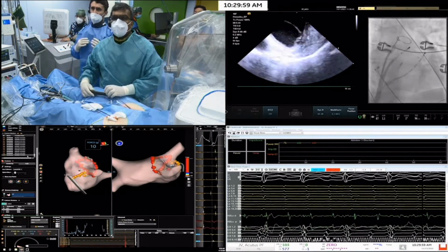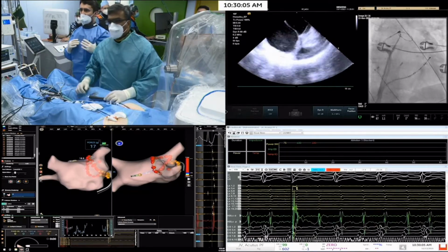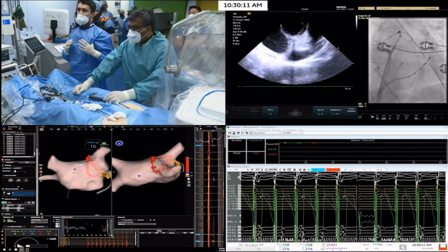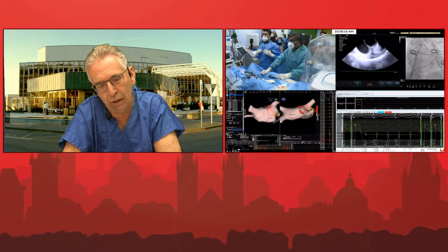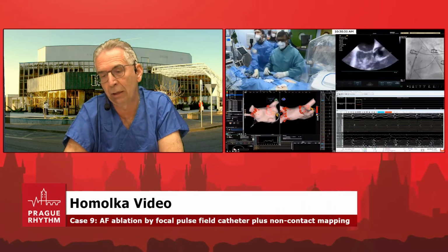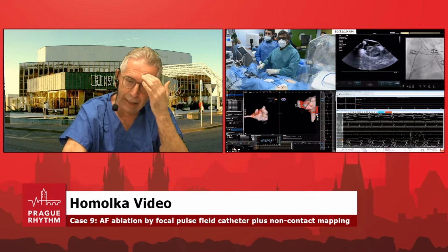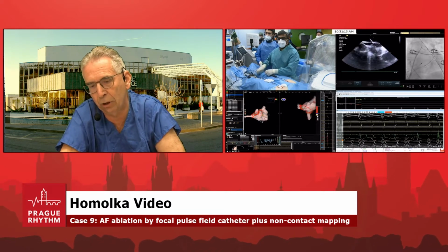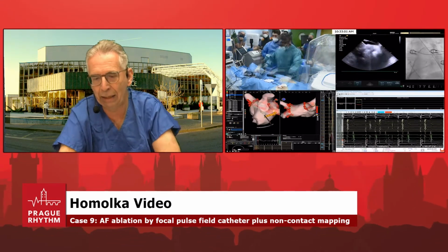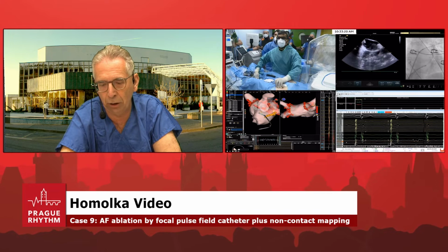Okay. Somebody mentioned that if we are using the focal PFA catheter in structures other than the ventricles or atrium, we can actually use even the PFA focal catheter in the CS, and it should be used with the Farapulse pulsed field catheter in the CS as well. He is trying to position the catheter in the coronary sinus, which is happening right now. And look, after just mechanical irritation, the tachycardia switched to sinus rhythm.